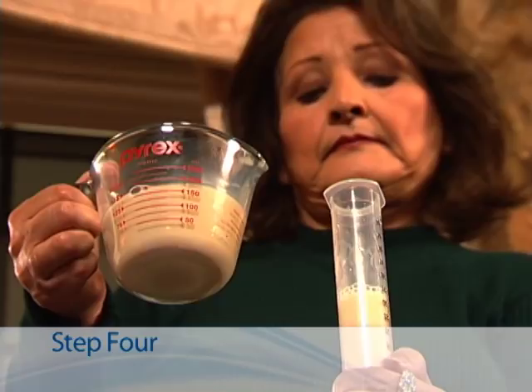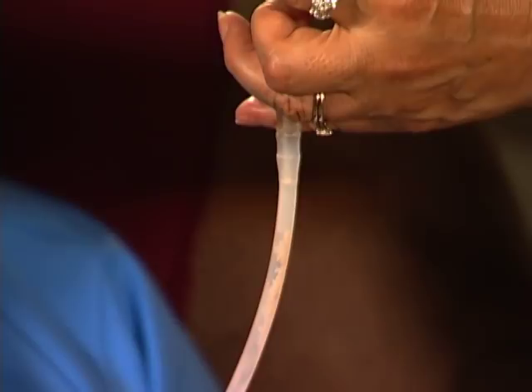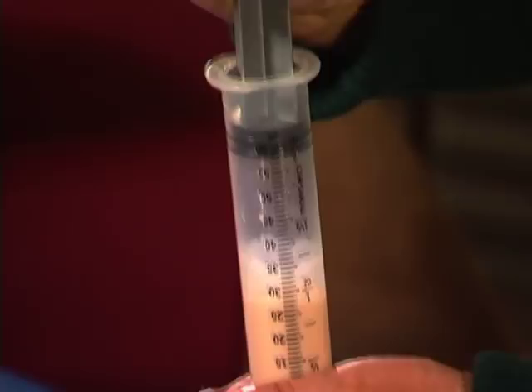Step 4. Giving the feeding. Hold the syringe upright and let gravity draw the formula through the tube. If needed, put the plunger back into the syringe and then gently push down to force the formula into the feeding tube.